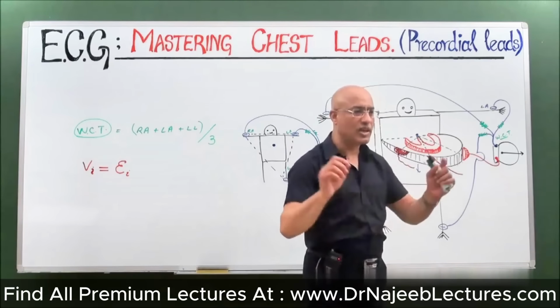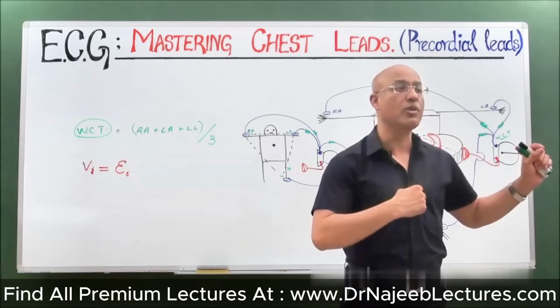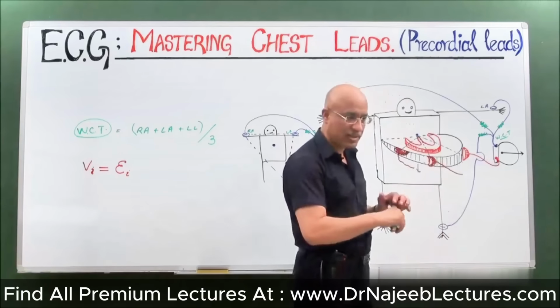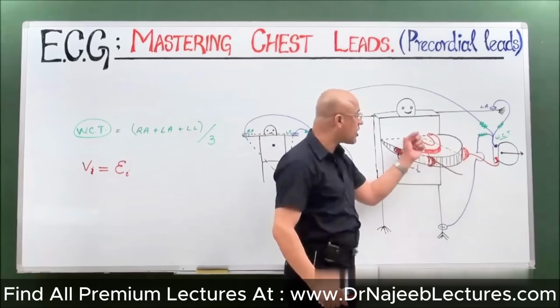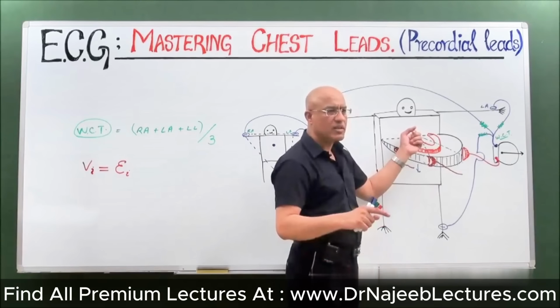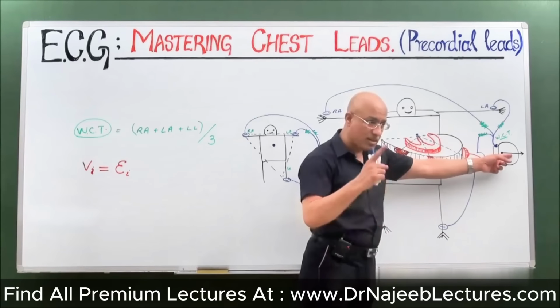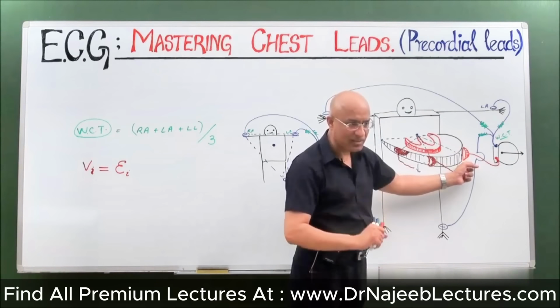All the ECG leads basically don't determine the absolute potential from a site. They determine the potential difference between 2 points. Here all the chest leads determine the potential difference between the exploring electrode and the virtual electrode. As we know, the virtual electrode is almost near zero. So for practical purposes, the lead is recording the potential which is actually mainly determined by the exploring electrode.